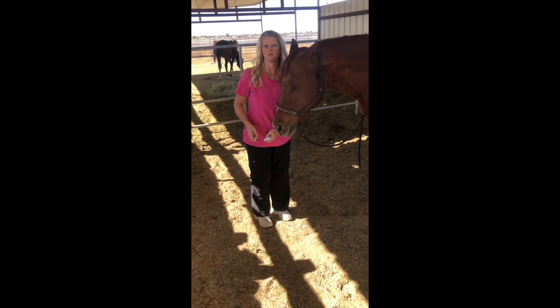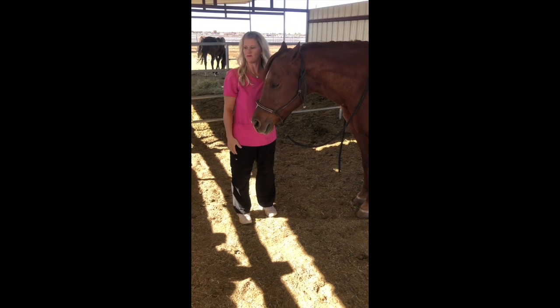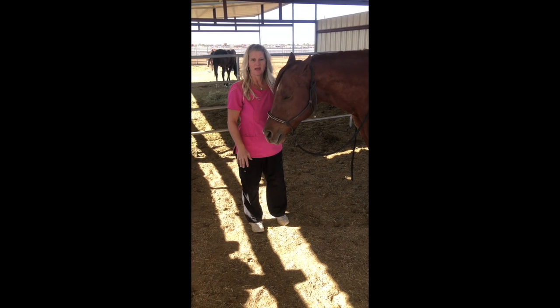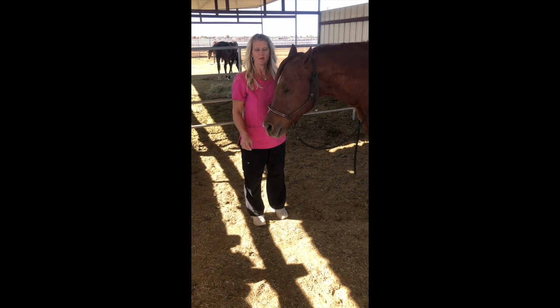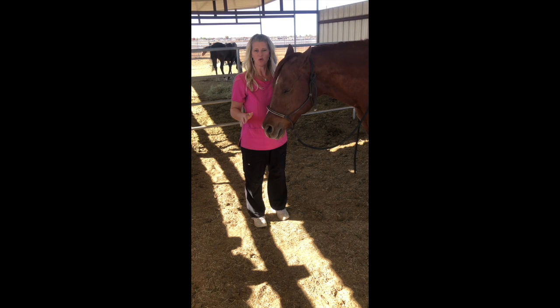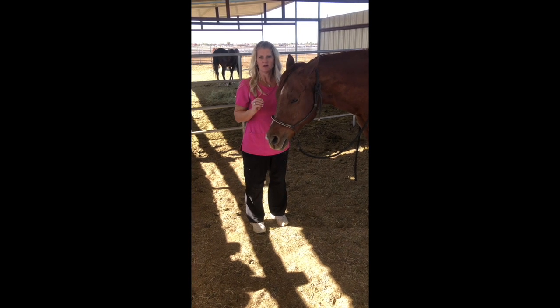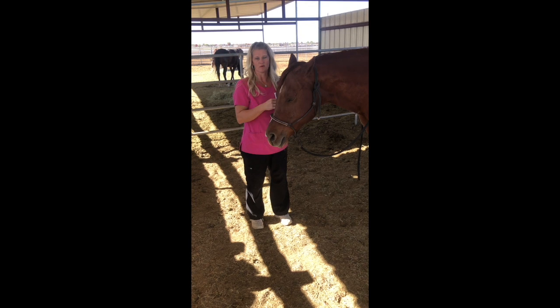Okay, taking a horse's temperature. The normal range for a horse is 98.5 to 101. And one of the things you want to do is take your horse's temperature at a normal time where they're not stressed or under pain or duress. That way you'll know where your benchmark is and what your horse's temperature is normally. Just in case you take their temperature in a stressful situation, and if it's higher than the normal range, you'll know that you're actually normal for your horse.